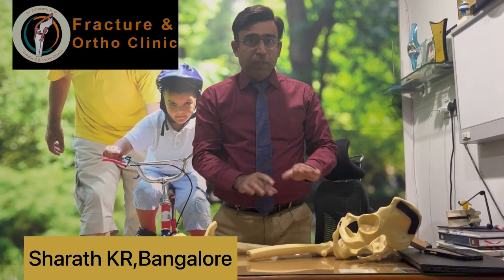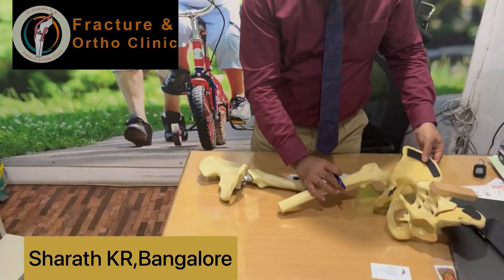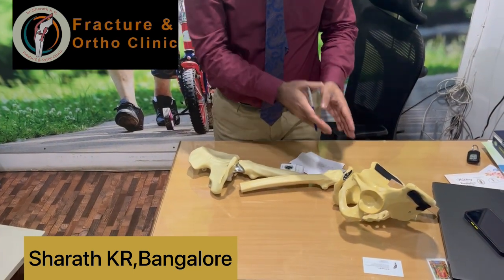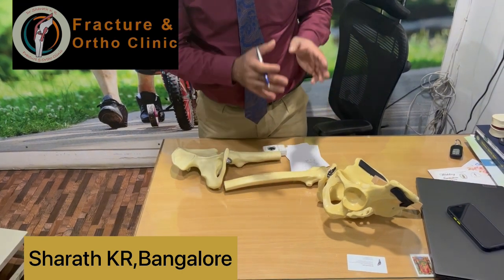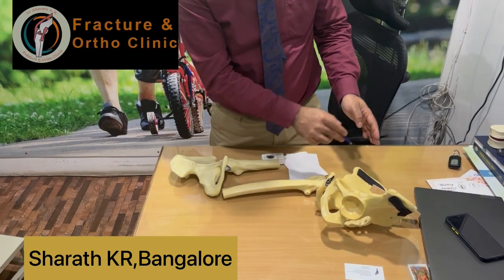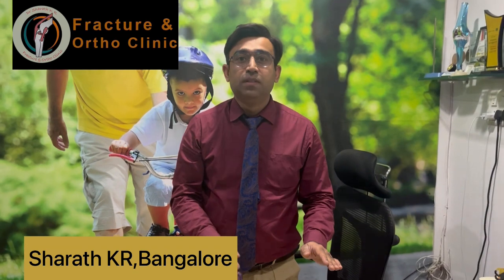Meaning, the patient is lying supine in the operation theatre, and the hip joint is lying like this. The operating surgeon is seeing the hip joint from the front. If I am seeing the hip joint from the front and the surgery is done from the front, it is called direct anterior hip replacement surgery.